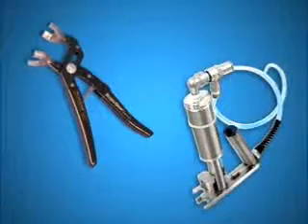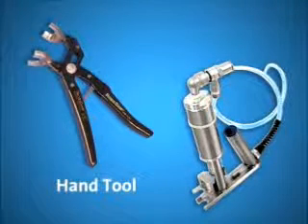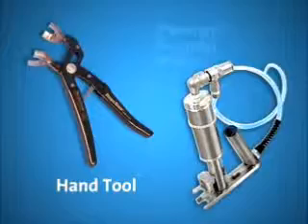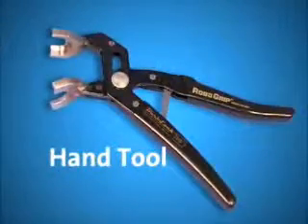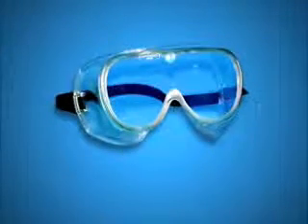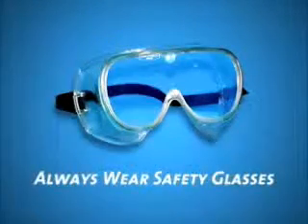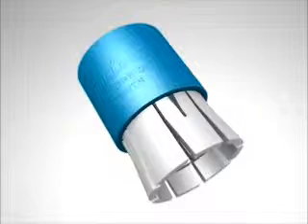There are 2 ways to assemble Barblock fittings. One is through the use of a hand tool. The second is by use of the Barblock pneumatic assembly device. The first method we'll be demonstrating is Barblock assembly using the hand tool. Please note, for your safety, it is very important to wear safety glasses when using any kind of Barblock assembly tool. Pre-lock the sleeve and collet.